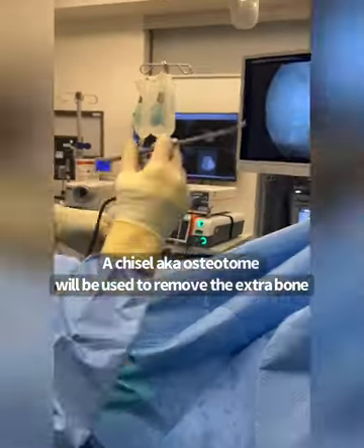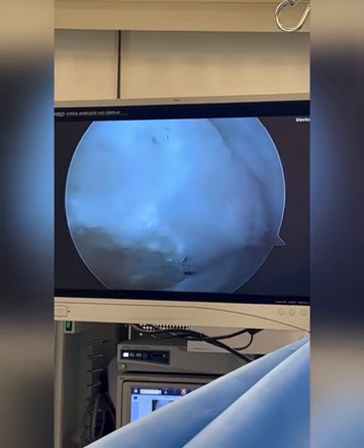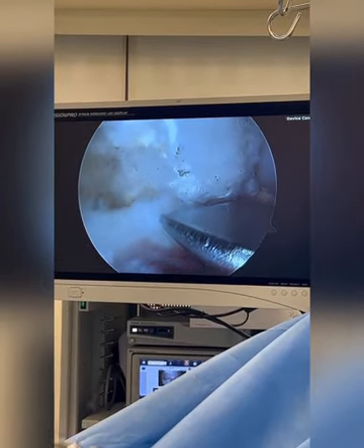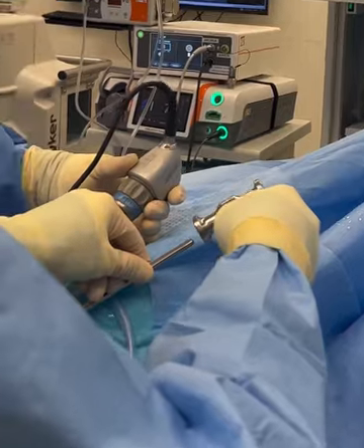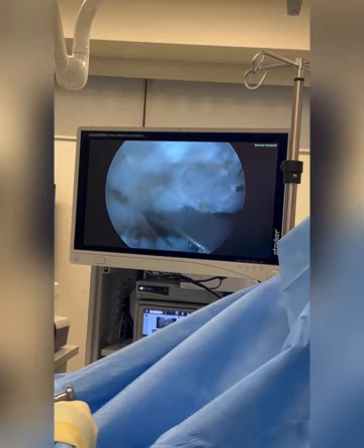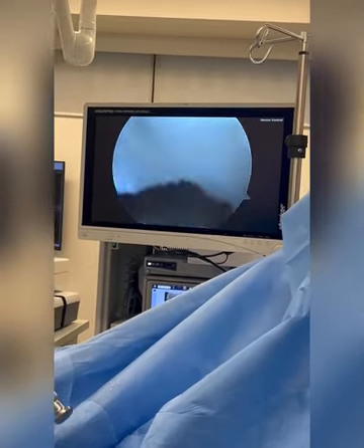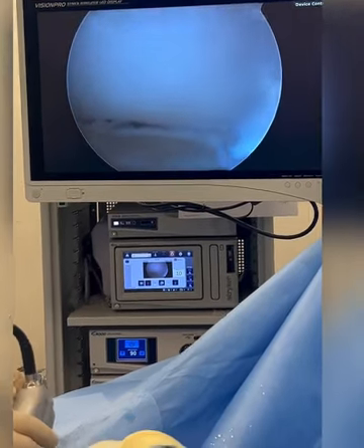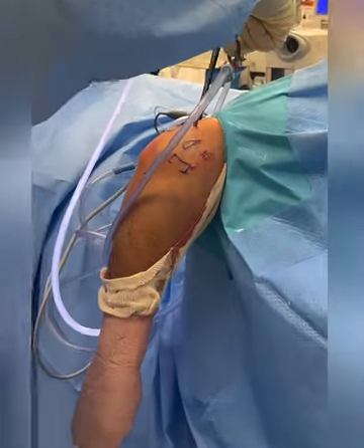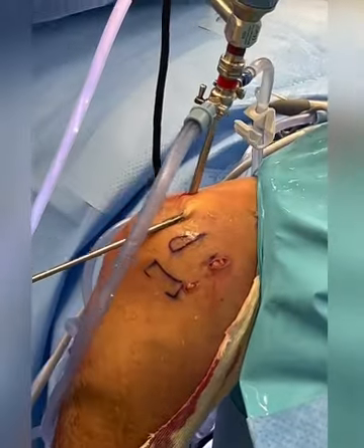I use an instrument that's like a little carpenter's chisel — you can see the chisel right here, also known as an osteotome. Watch what I do: I use a steel mallet and go like this to remove the piece. It'll break right off because it doesn't really belong there. I'll hold the scope here for a moment just to show you where we are — and you can see those spurs coming out right there.